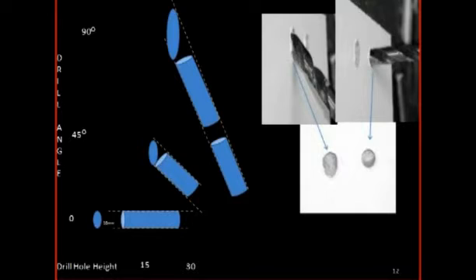If, for example, we intend to drill a 10 mm hole using a 10 mm drill, the drill must enter while perpendicular to the drilled surface. If we angle the drill from a horizontal to more vertical positions, the heights of the drill holes increase proportionately. This effect is especially significant if the drill reaches the femur through the tibial drill hole, as there is no room for adjusting the angle. This was probably a major factor in accepting erroneously the roof of the intercondylar notch as the site for the femoral drill hole.